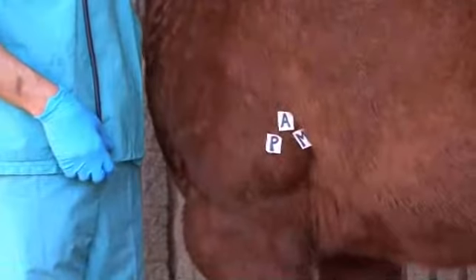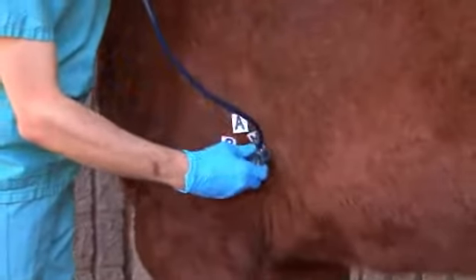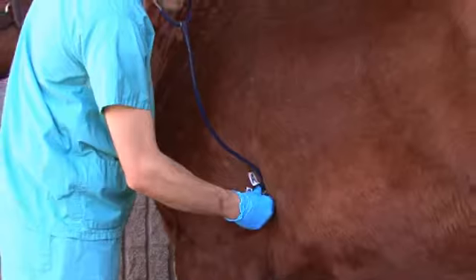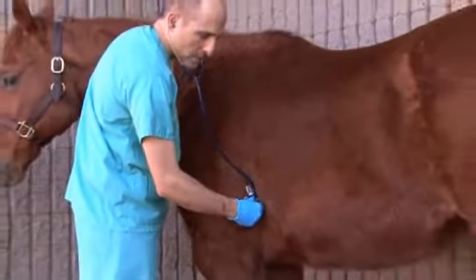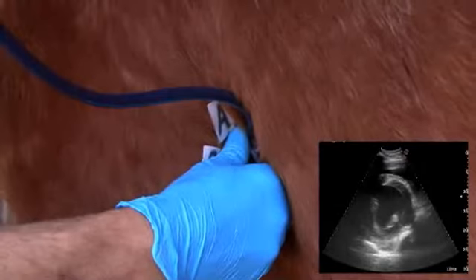For purposes of illustration, I'm going to leave the landmarks in place as I auscult. And I'm going to start with the mitral. And what I'm hearing is a lub-dub, lub-dub, lub-dub.